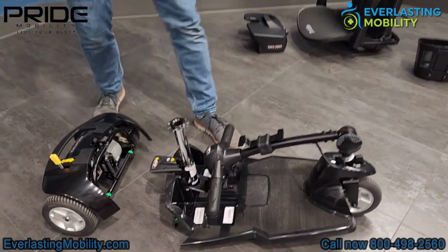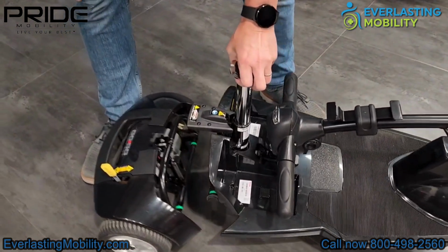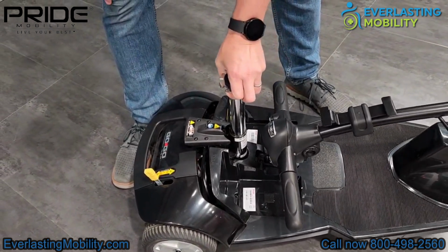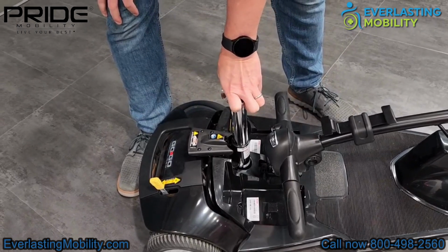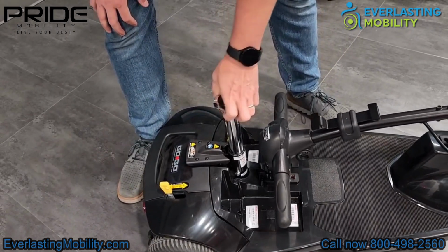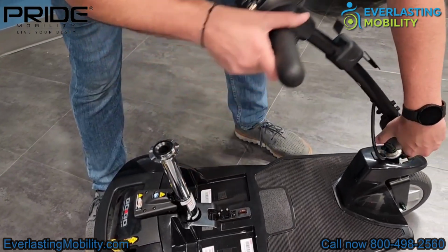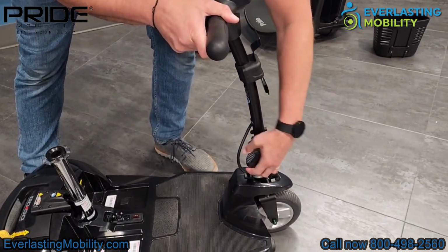Now to reassemble, it's simple as well. You would just take the front half portion of the scooter, and there's 2 little hooks. You would line them up on the rear axle bar, and once you have them lined up, you just let go and it will snap into place. The next step is you would adjust the tiller up, lock that into place. You also want to make sure that you unlock the locking mechanism on the front tiller so you can actually steer the scooter.